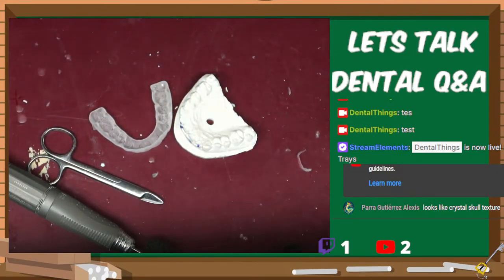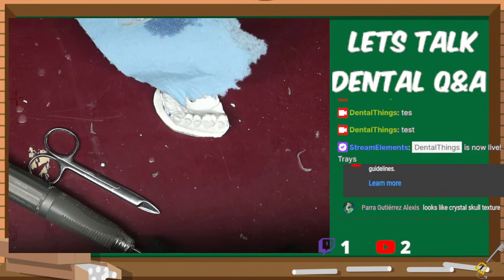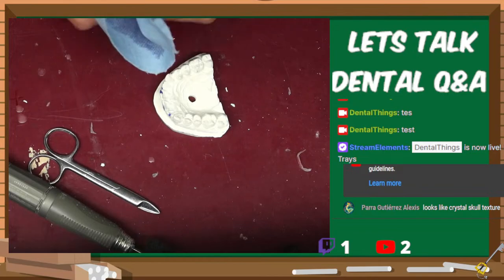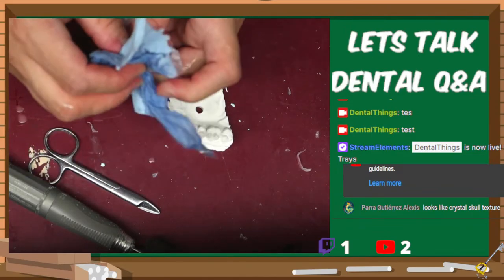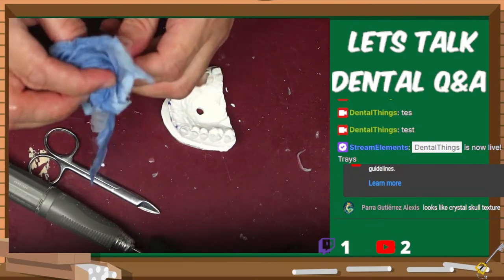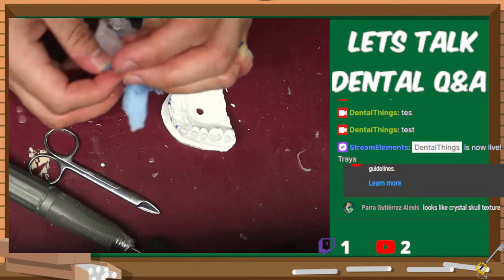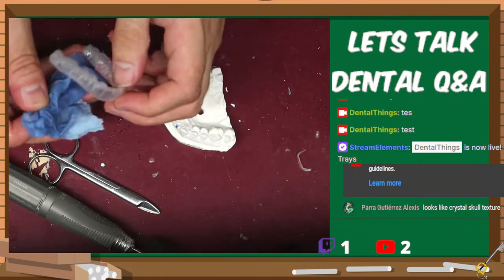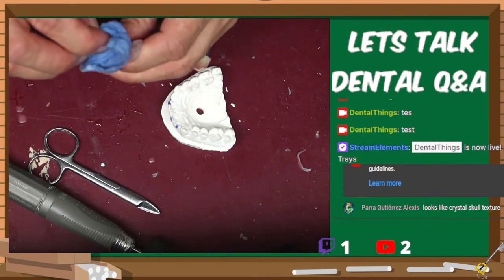I could run it in an ultrasonic if I wanted to help make it look a little bit cleaner, but it doesn't take too much to just buff it out, get all the loose bits out of there. And thankfully, because it is made of plastic, you can really put a grind to it as you go and buff it out a little bit. Another thing I can do, which I probably will, is take it to my dental lathe and put a little bit of high shine on there to really make it look crystal clear. A little bit of pumice, a little bit of high shine will make it look really nice. And it doesn't take too long. It takes a couple of passes.